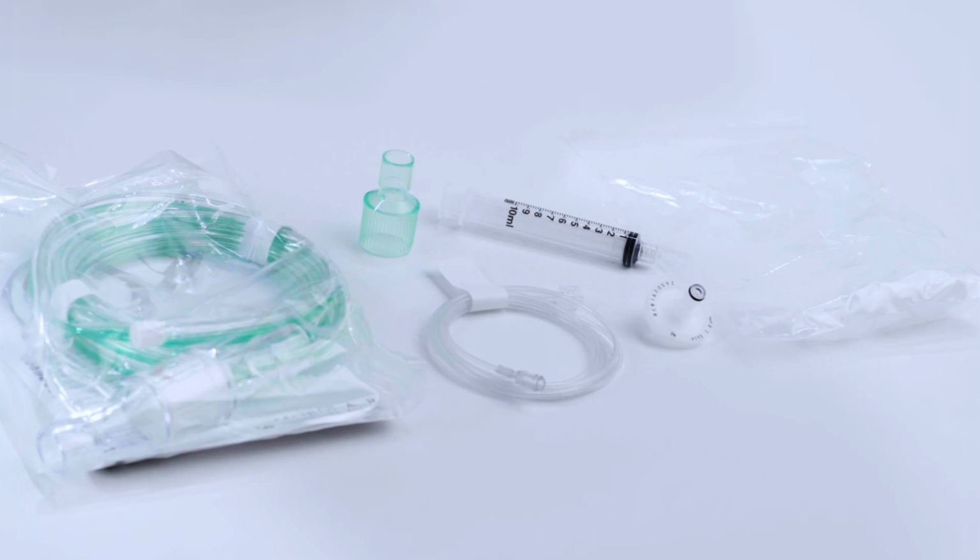These connectors are different in each NOx kit, specific to the patient breathing circuit.